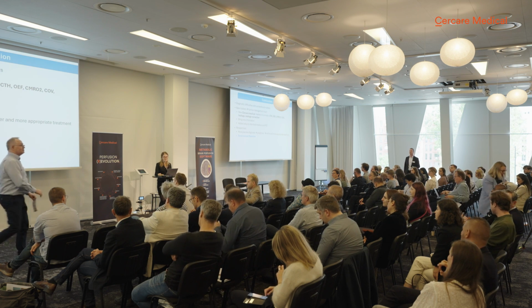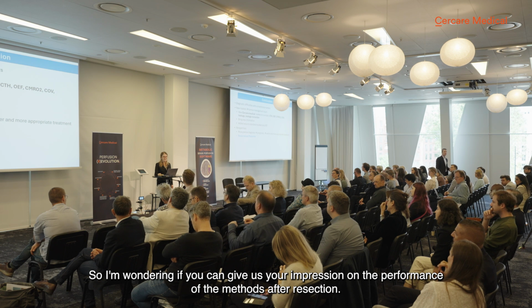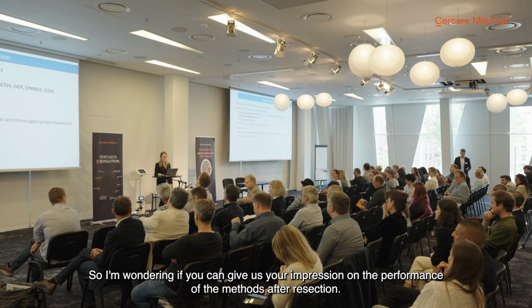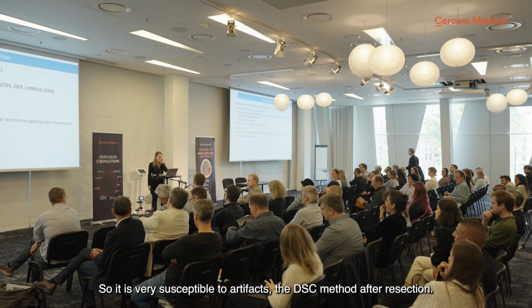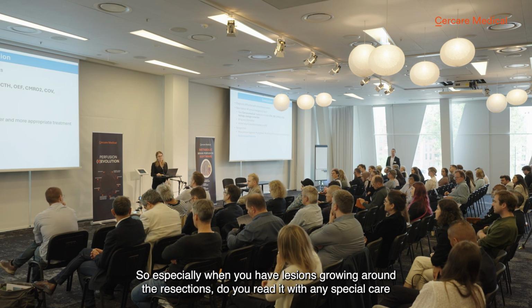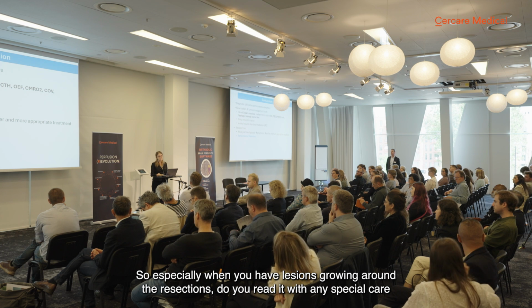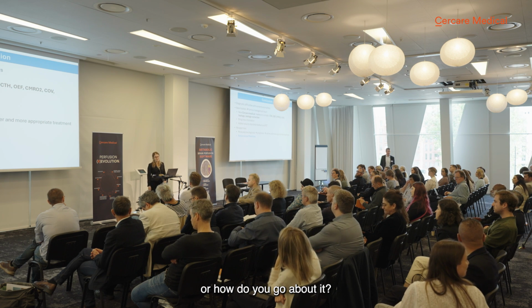Yes, thank you very much. I'm wondering if you can give us your impression on the performance of the methods after resection. The DSC method after resection is very susceptible to artifacts, especially when you have lesions growing around the resection. Do you read it with any special care, or how do you go about it?